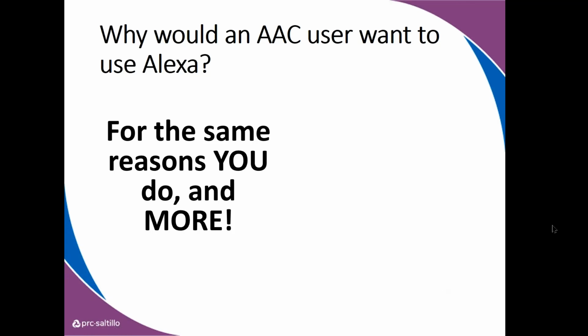I love it. Ask about the temperature. There you go. What's the weather outside? Timers are another great way. Yeah, using more timers. I use it all the time for cooking because you could set multiple timers, not just the one timer on your stove, right? So I could say, Alexa, give me a 10-minute timer for the beans. Give me a 50-minute timer for the ham. I love it. Somebody's playing Jeopardy after dinner. Excellent. So you're already playing with it. You already have some ideas of things that Alexa can kind of do out of the box.